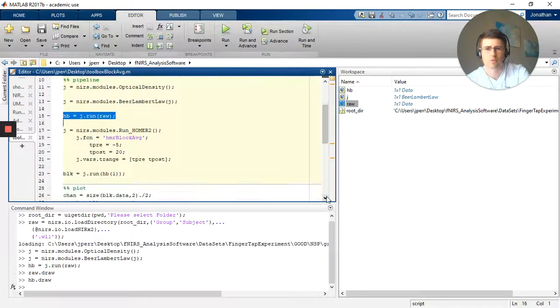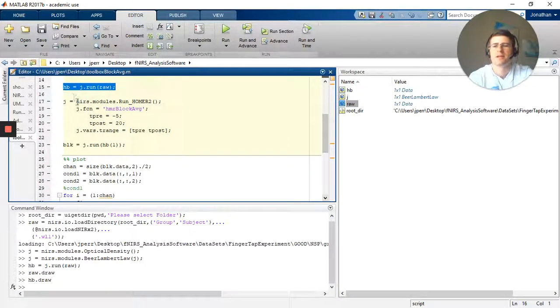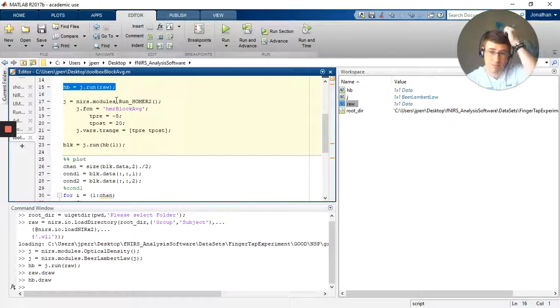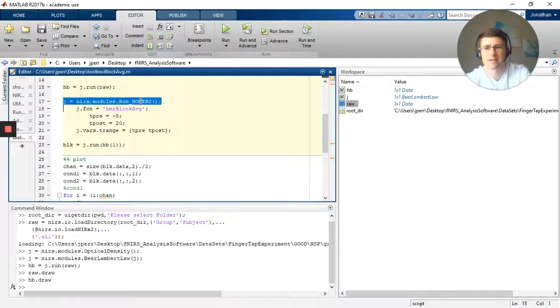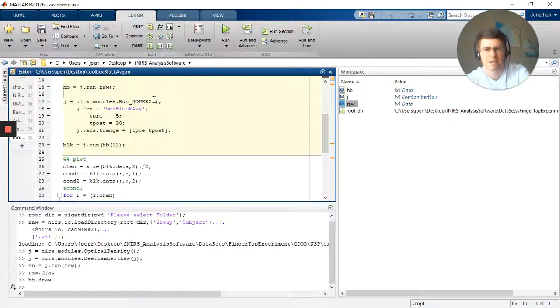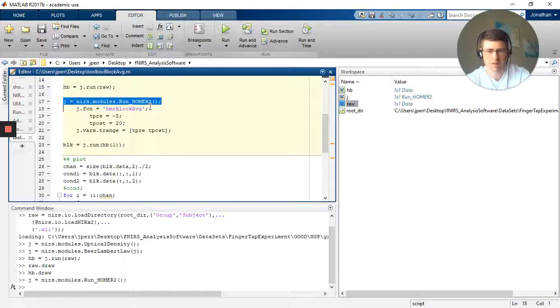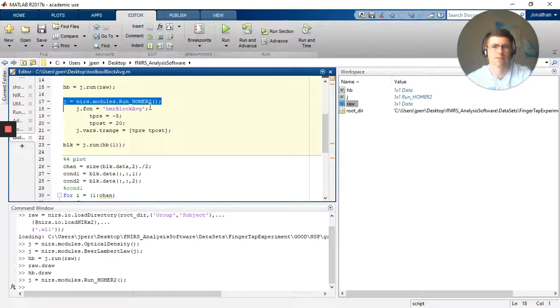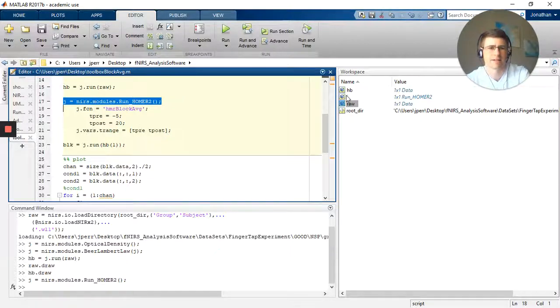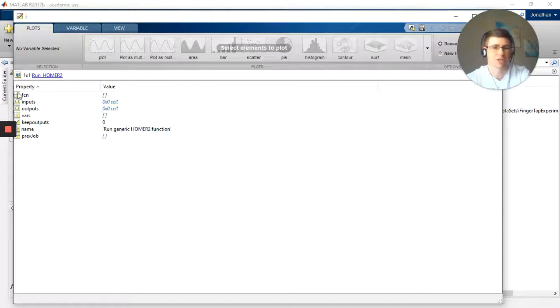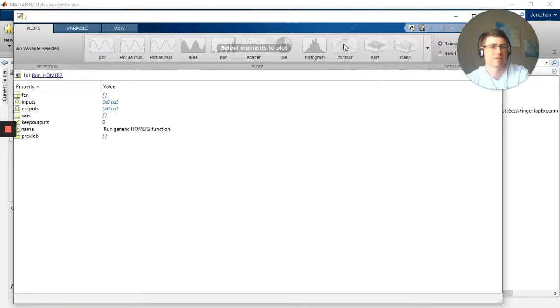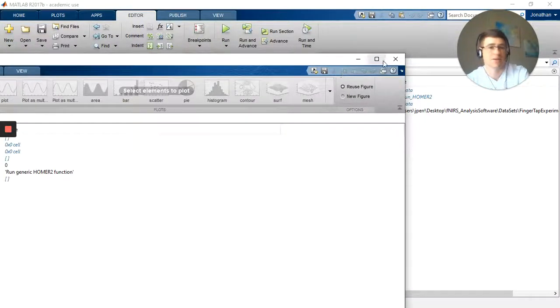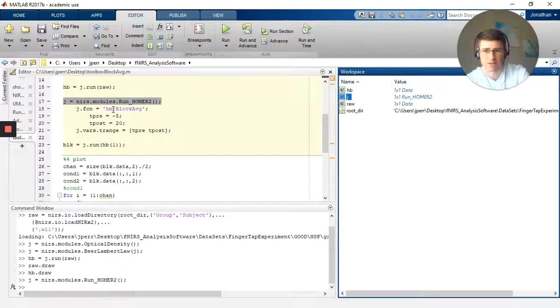Okay, so now we'll get to the runHomer2 module. So you go to the NIRS folder, the modules subfolder, and you go runHomer2 is the actual function. So I'll evaluate. You'll notice it's empty, I'm starting a new pipeline here. I've already used up the other pipeline. You can keep it going if you wanted to, but we don't need to at this point. So okay I've created it. So I open it up and you see I have an fcn, which is empty. That stands for function, it means which function, which Homer2 function do you want to run. And then vars stands for variables and it's empty. The vars is actually dependent on the function that you're going to use, so it's the input variables.